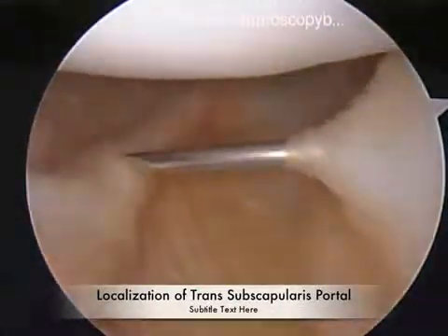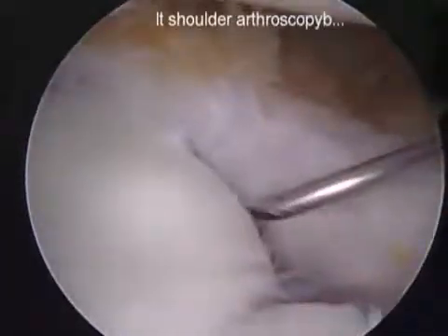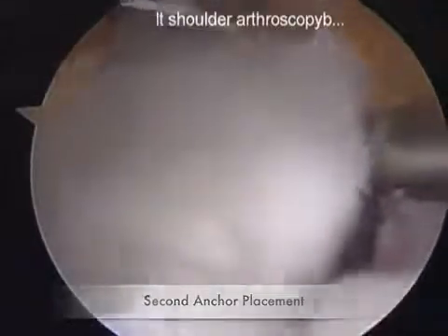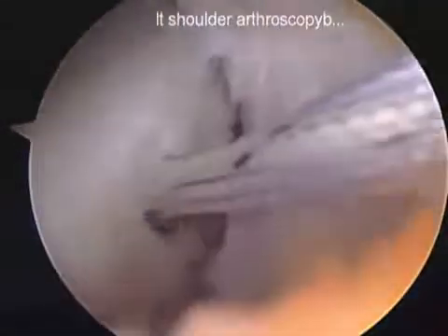A spinal needle is again utilized to localize the transsubscapularis percutaneous approach for the second anchor placement. The drill guide is placed on the subchondral bone to ensure that the anchor placement will be parallel to the drill holes in the bony fragment.